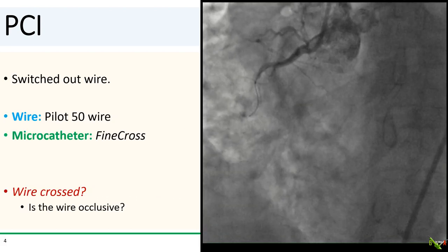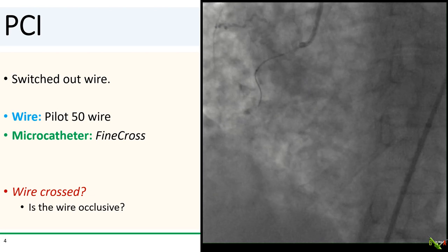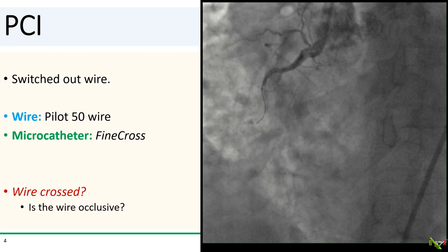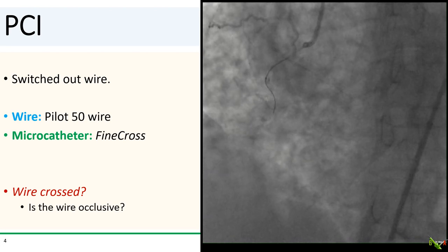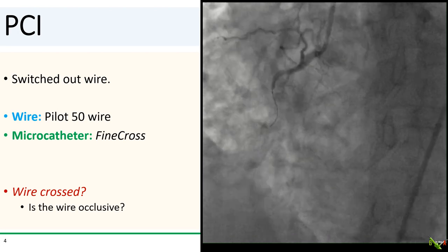So we switched the BMW wire out to a Pilot 50, which is a hydrophilic wire, and we placed it through a fine cross microcatheter. The Pilot 50 wire did go a little bit further, but now there's no flow.